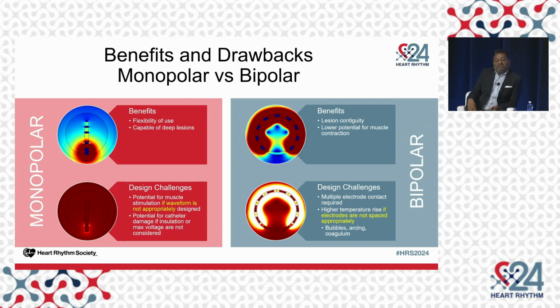And then the benefit of bipolar, obviously, is having contiguous lesions between the electrodes. And when you have bipolar energy delivered, there's less susceptibility to muscle contraction, which might lead to some workflow advantages. If you potentially don't have to intubate, you don't have to paralyze.